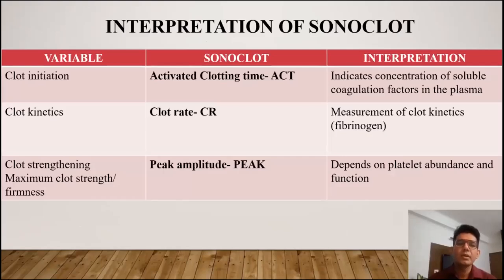Coming to the interpretation of SonoClot, for clot initiation we have the activated clotting time, that is the ACT, which is equivalent to the R time of TEG. Then we have clot kinetics, where we have the clot rate, which is equivalent to the K time of TEG. And for clot strengthening, we have the peak amplitude or the peak, which is equivalent to the maximum amplitude in terms of TEG. The interpretation will remain the same.